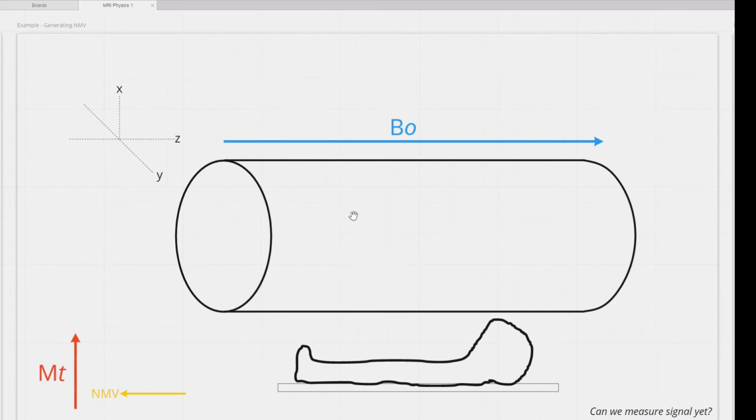And by doing that, by putting a bunch of juice through these coils at low temperatures, we are able to generate a resting magnetic field, baseline magnetic field, okay, B naught. This is your 1.5 Tesla. This is your 3 Tesla. This is your 5, 7, 9, 11, etc. And the more research experimental magnets.